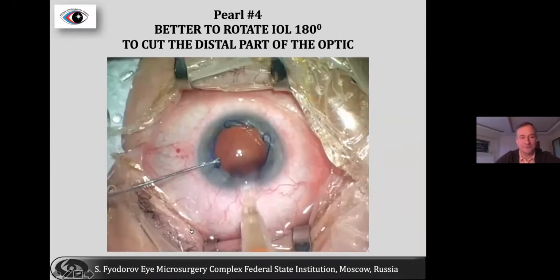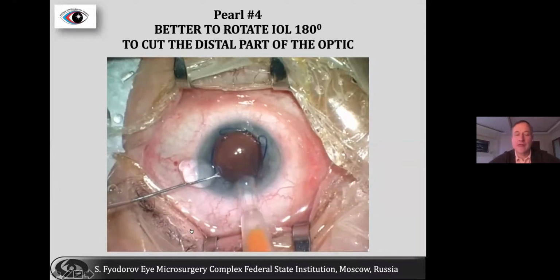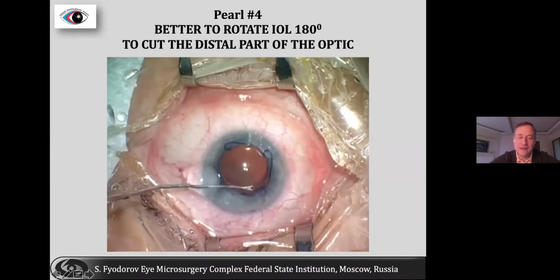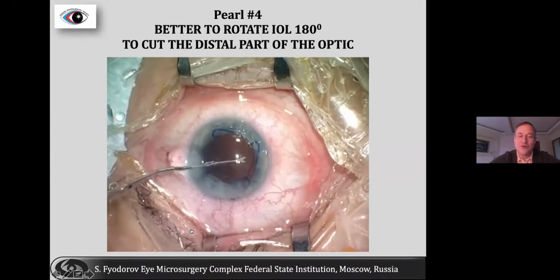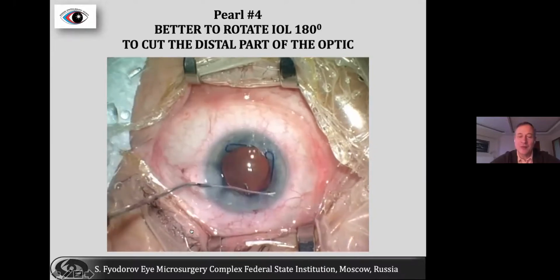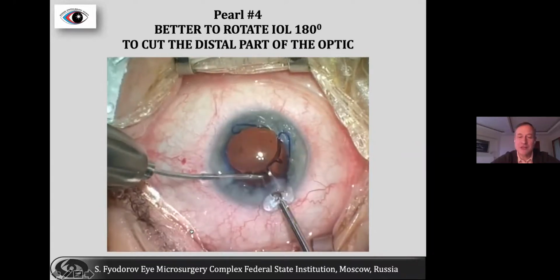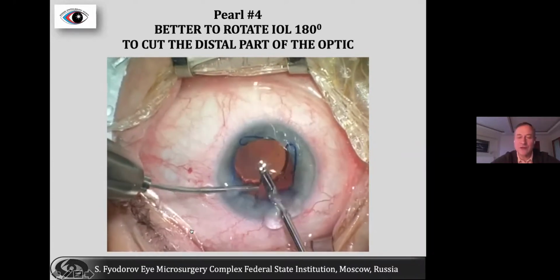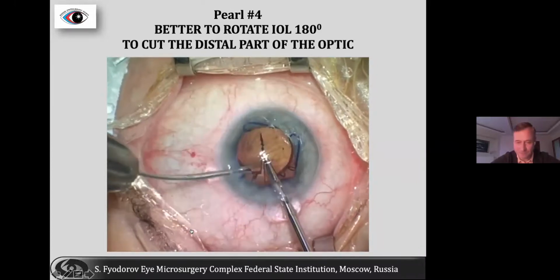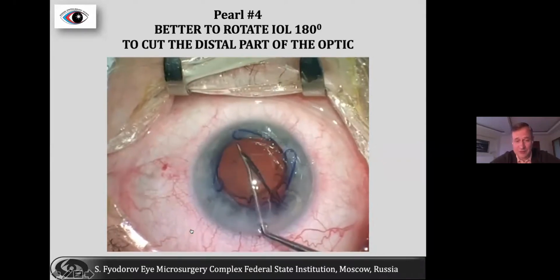So that's why in many cases, like in that one, I was implanting a hydrophilic acrylic IOL, and suddenly I realized that both haptic elements were damaged. The upper haptic elements were damaged inside the injector. So there is no way I can leave this implant inside the capsular bag, because the position will not be stable.